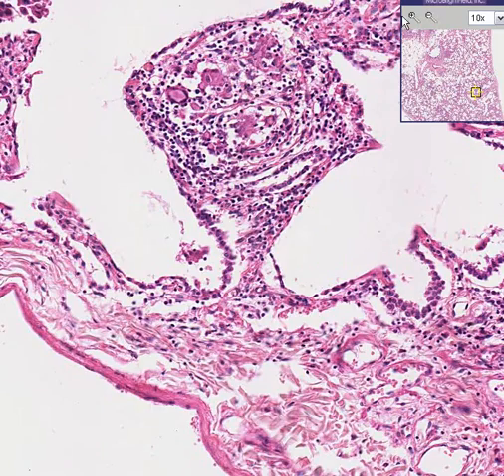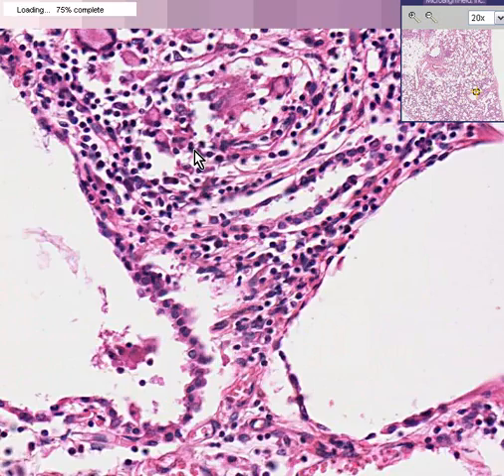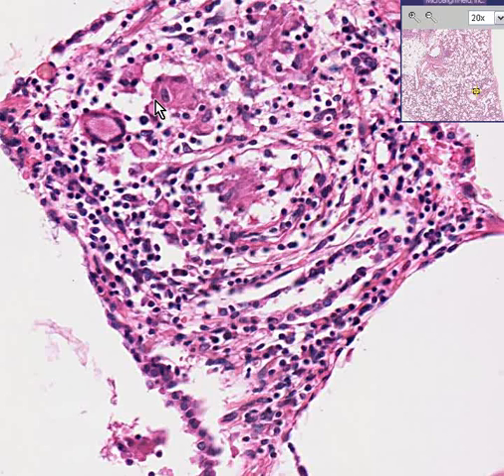You can see the epithelioid histiocytes, or macrophages, if you will. You can see the fact that they are coalescing to form giant cells. You can see some sprinkling of lymphocytes. This is non-caseating granulomatous disease of lung, which in most cases turns out to be sarcoidosis, a granulomatous disease still of very obscure etiology, found in young women, 20s, 30s, especially of African American heritage.